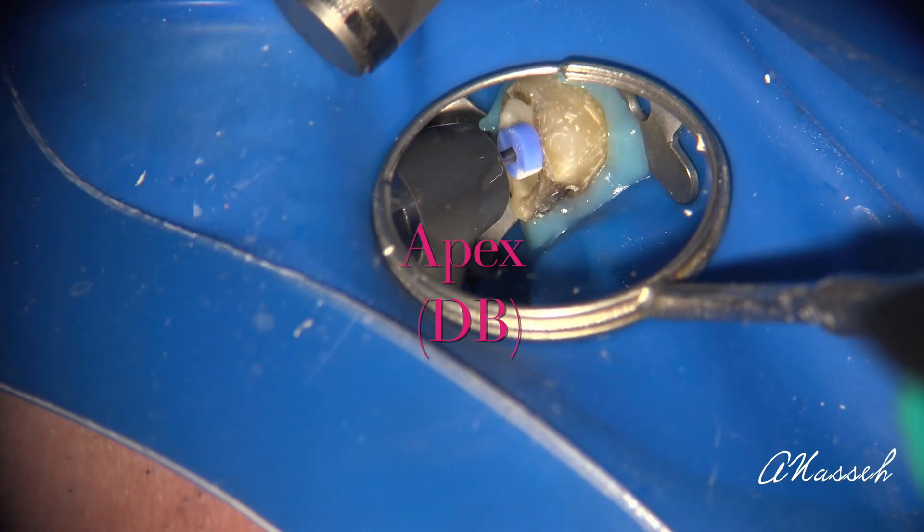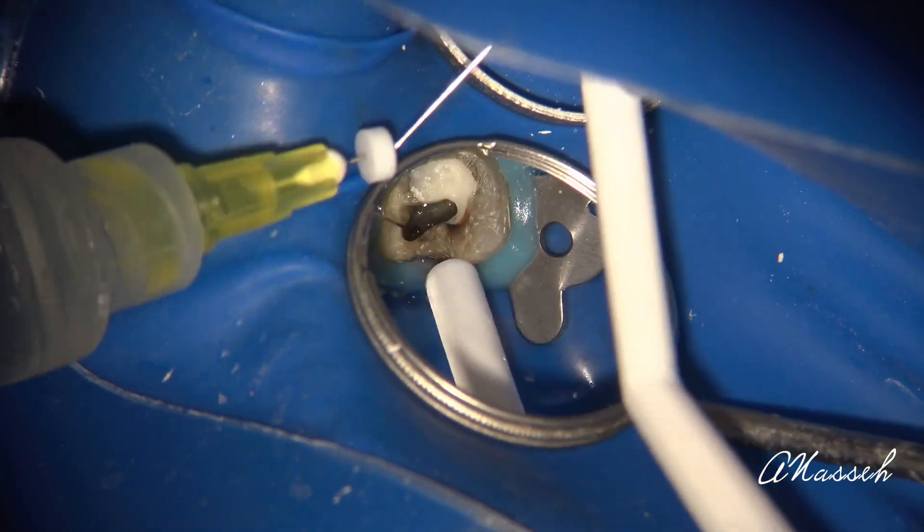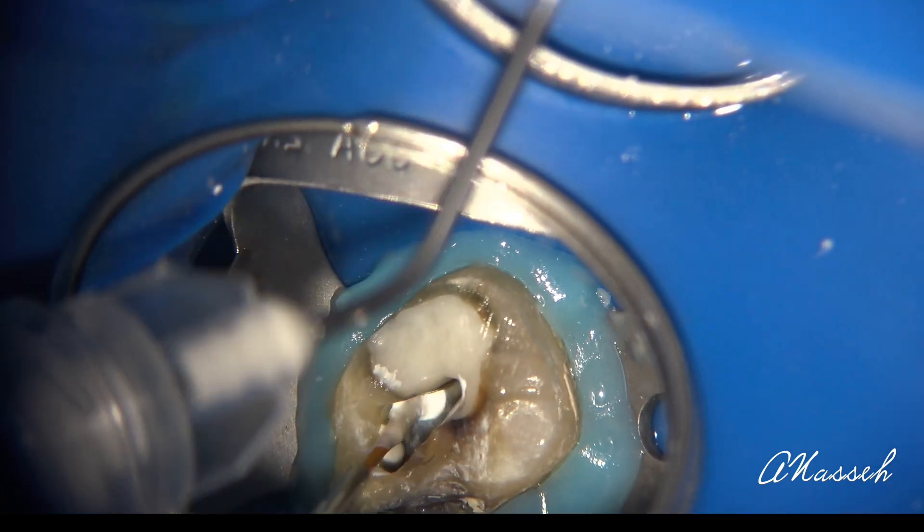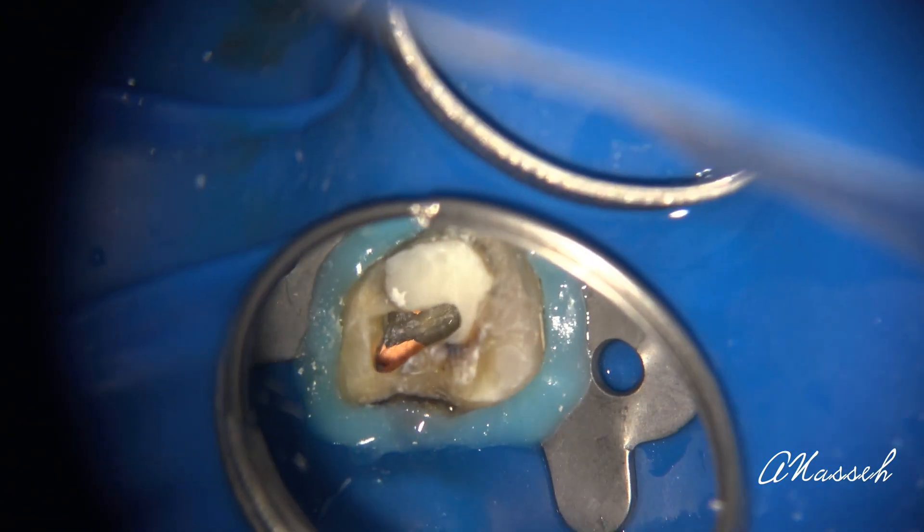After the 30 has reached the apex, do your final irrigation, then dry and fill the canal with a matching size 3004 BC cone — or one size smaller cone — whichever is a good fit and has some tuck back. Then use hydraulic condensation to complete the obturation. This is a very simple instrumentation technique and, because of the reverse OTR motion and reciprocation, it's also very safe.